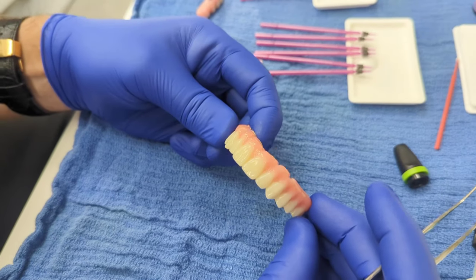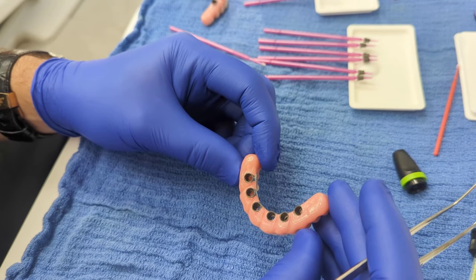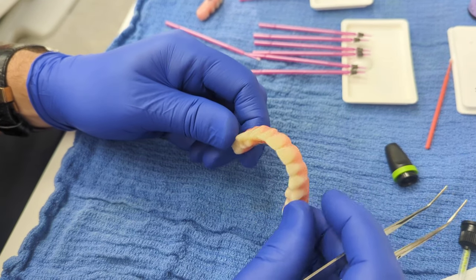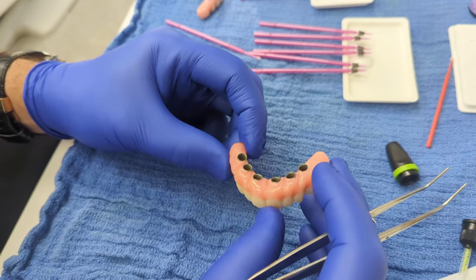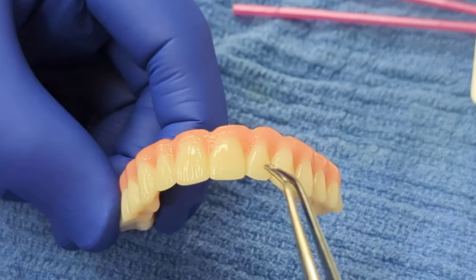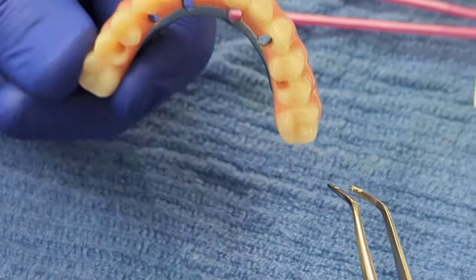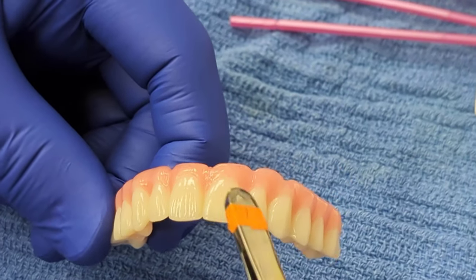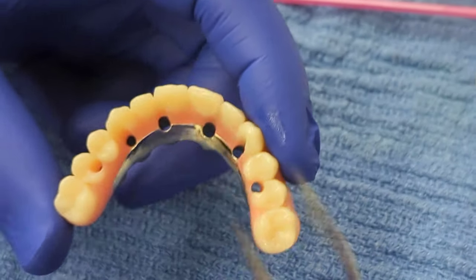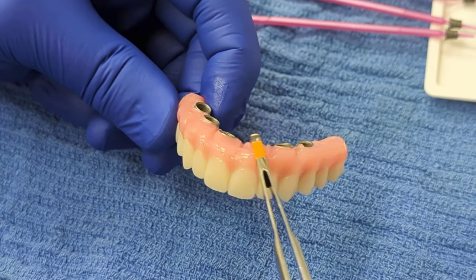I want to talk about the materials of a Generation 4 Highbridge real quick. This is a question that comes up a lot relative to all the other materials that are available on the market these days, primarily zirconia or crystal ultra or whatever. So this is a milled PMMA. It's a double cross-linked acrylic that is milled out of a puck. And this acrylic happens to be an Ivoclar material. Very dense, very strong, and wear resistant. But at the end of the day, it is acrylic. It's not a ceramic. This is an Ivocap injected acrylic.